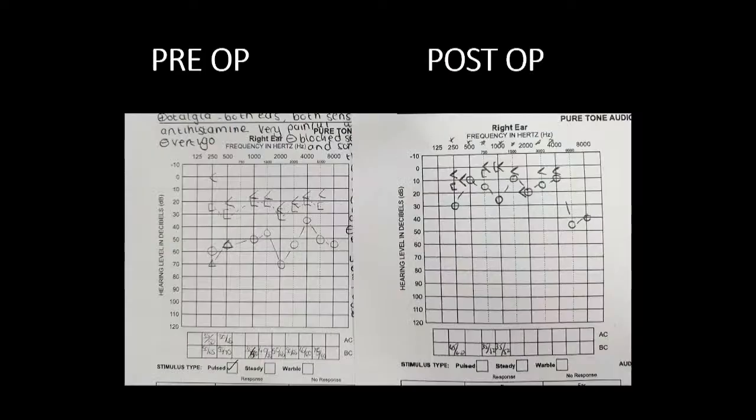That was our pre and post. So, I'm going to pass on that for time. What happens? The scary thing: you've gone in, you've decided you're going to put some Ketac-Cem on your little nubbin of stapes or something, and the stuff spills on the footplate. So I'm going to do a real-time surgery here, in the sense that I don't want to edit this, just so you can see exactly what happened.